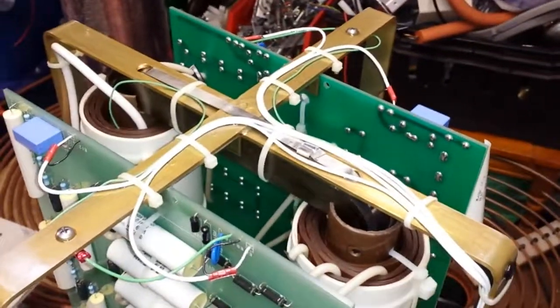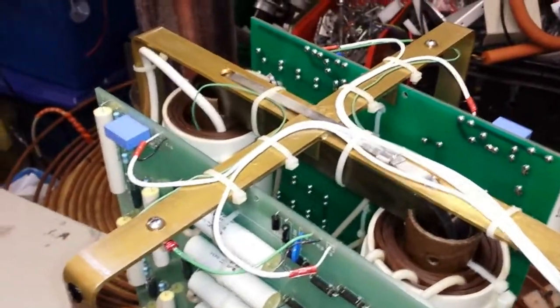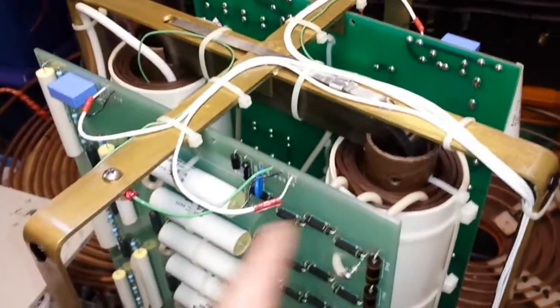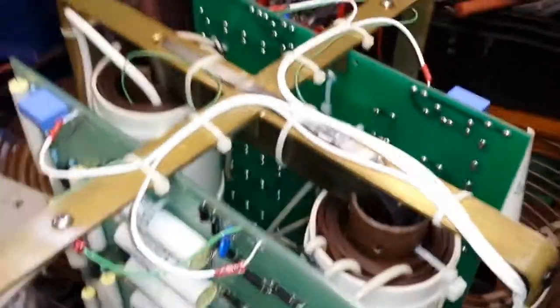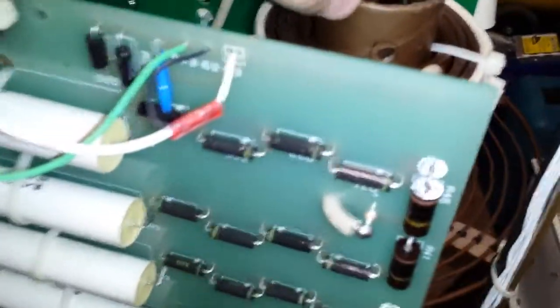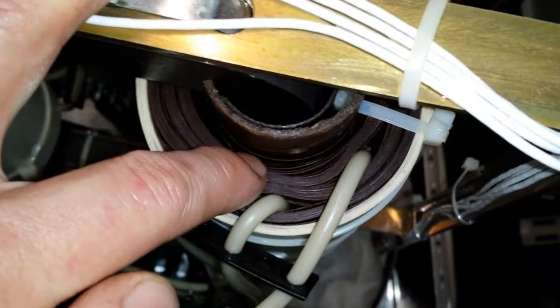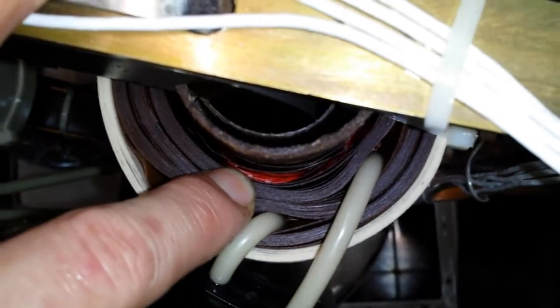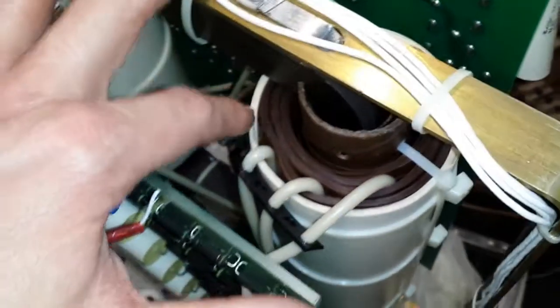The windings of the coil, though, will be actually impregnated with the oil, so it'll take a very, very long time for this to actually dry out. So what I'll keep doing is making sure that the windings do stay damp with oil, because I wouldn't want it to physically completely dry out. The actual core between the secondary? Yeah, the primary is actually down there, the end of my finger, right down there. There you go, you can just see it. That's the primary. There'll probably be about 30 turns or something like that, because it's run on a frequency.